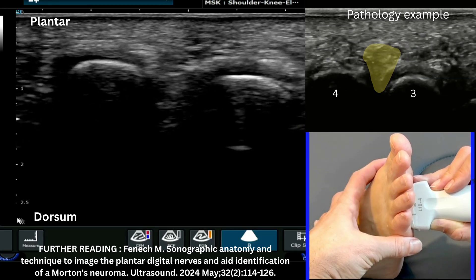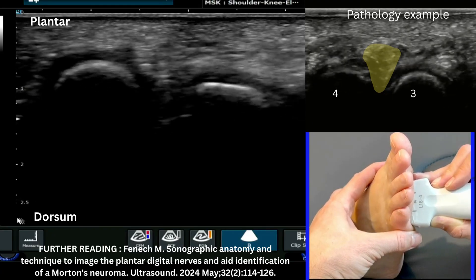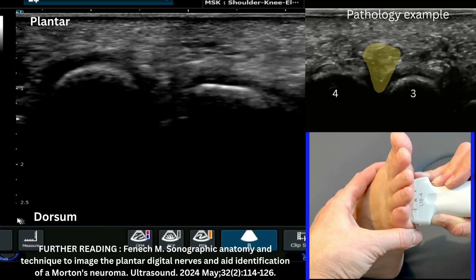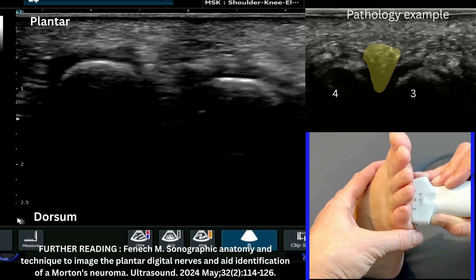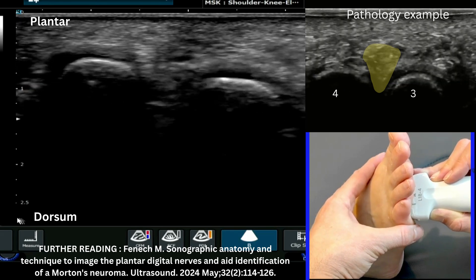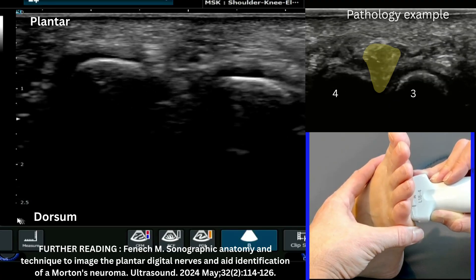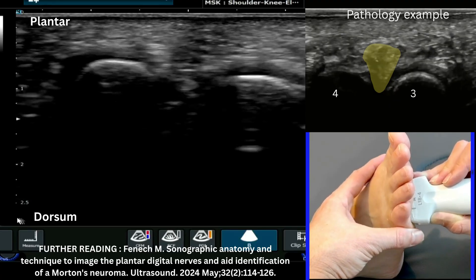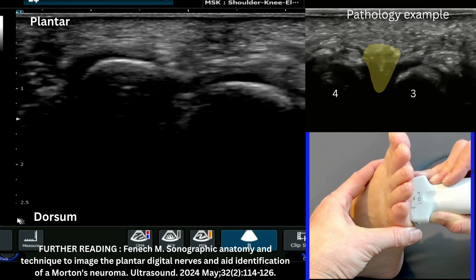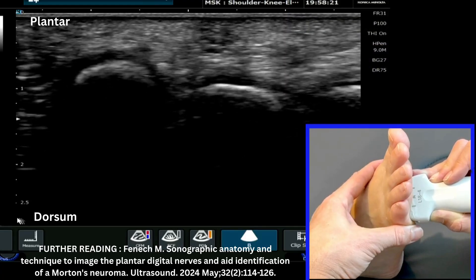Now we perform what is known as a sonographic Mulder's click: squeeze the two metatarsals together. If a Morton's neuroma is present, you might feel a click, the patient may complain of pain, and you may see a hypoechoic structure essentially pop down towards the plantar aspect between the two white domes in the webspace. I'm squeezing them together here to see if I can elicit any response or pick up changes of a neuroma popping down towards the plantar aspect.